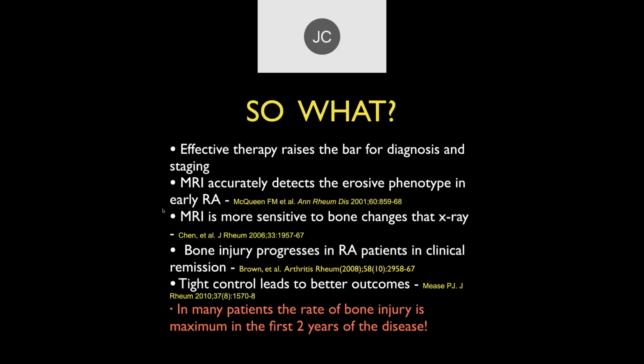Well, I think, and these are slides that I made almost 15 years ago now, that effective therapy really raised the bar for diagnosis and staging of this disease, especially making the diagnosis earlier than before. There are a lot of data showing that MRI accurately detects erosive phenotype in early rheumatoid arthritis. MRI is more sensitive to bone changes than X-ray techniques.